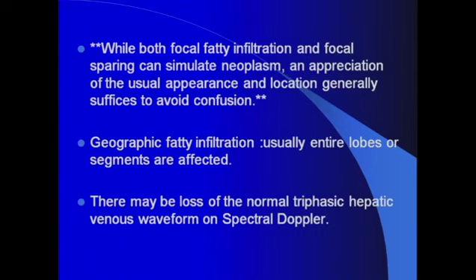The other thing that you may encounter in practice while you're evaluating the liver is geographic fatty infiltration.